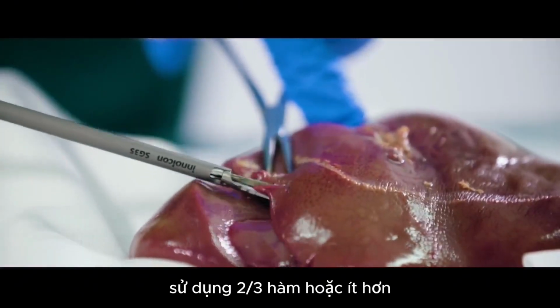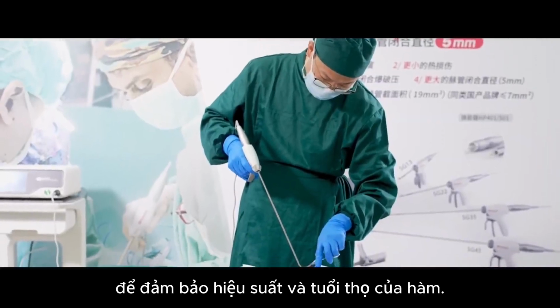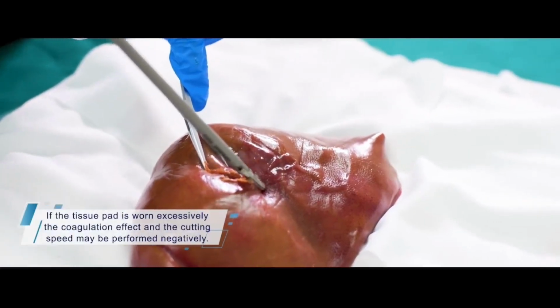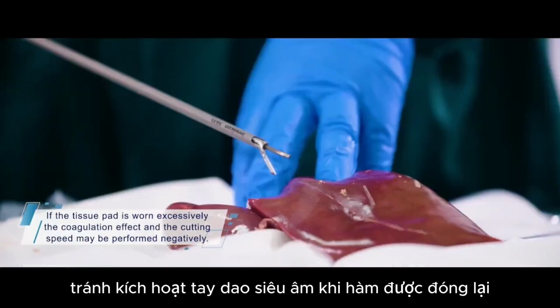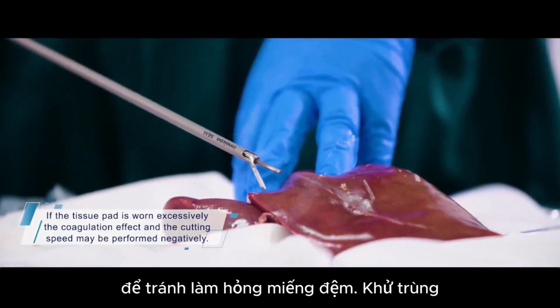Use 2/3 or less of the jaws to ensure its performance and lifetime. Sixth, after dissecting the tissue, open the jaw immediately. Avoid activating the scalpel while the jaw is closed with no tissue inside to avoid damaging of the pad.